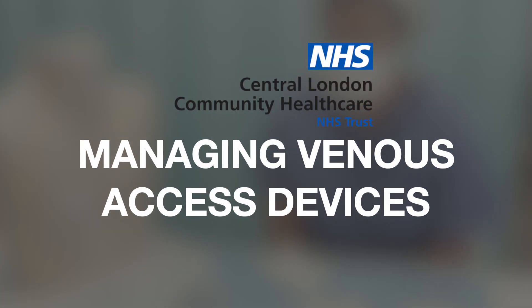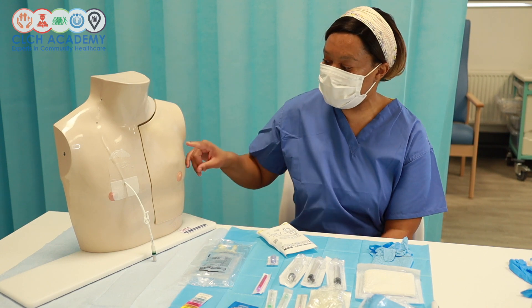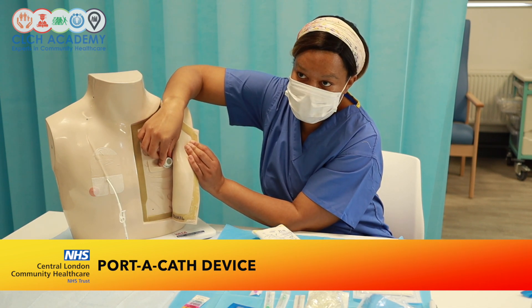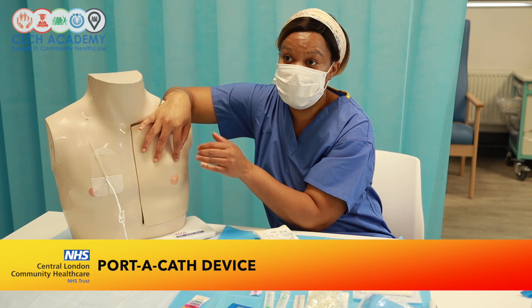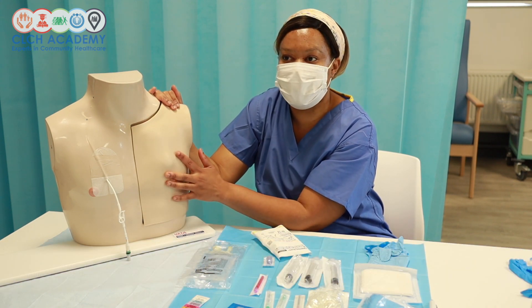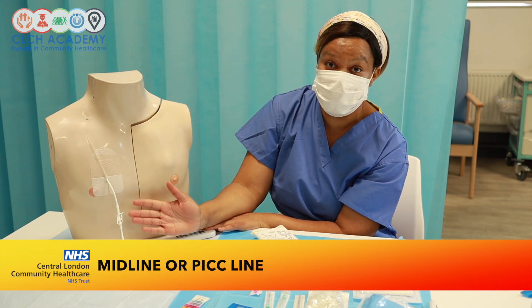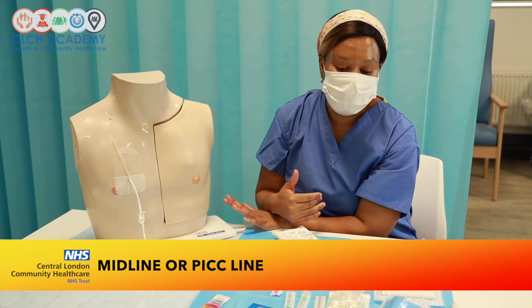Today's session is on managing central venous access devices. We'll be looking at the portacath — you can see where it sits on the mannequin, with the light rim visible across the skin. We'll also look at how to manage a midline, Hickman line, or PICC line, including measuring the line to check for migration, ensuring the dressing is intact, and investigating VIP scores and visible insertion sites.